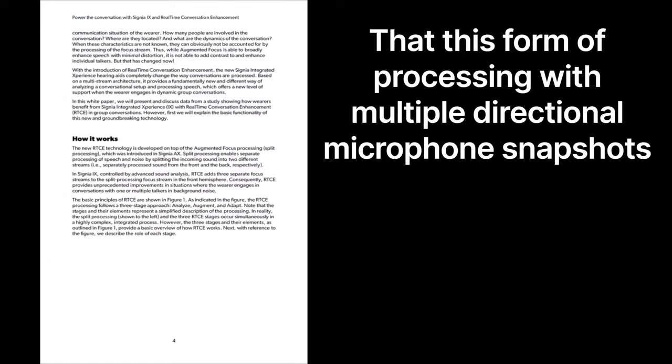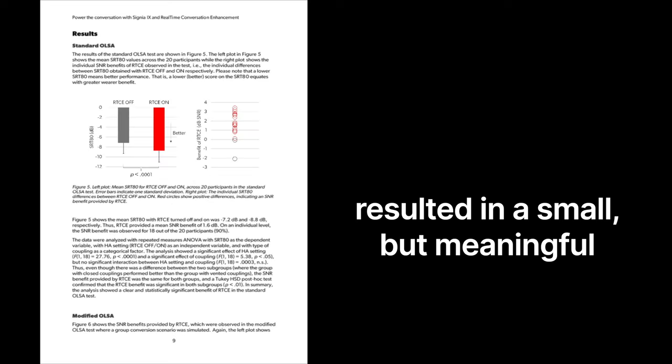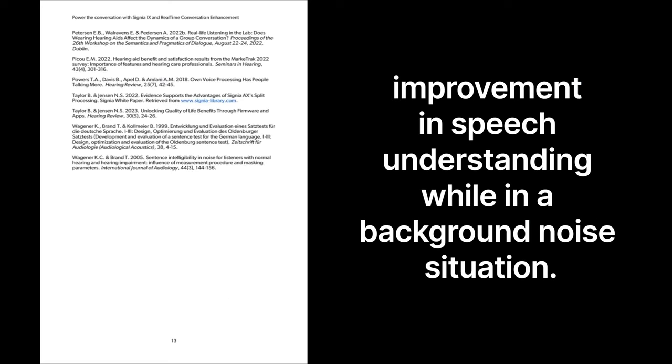Now that you have a decent understanding of what these hearing aids do, how do they actually work in background noise? Honestly, it's impressive and I definitely feel like it's better than the previous generation AX. I liked most that these hearing aids switch back and forth very quickly when different people are talking to me. However, if two people talk to me at the same time, I still can't understand either of them. A Signia white paper showed that 95% of individuals experienced better complex speech testing results, with a small but meaningful improvement in speech understanding in background noise.